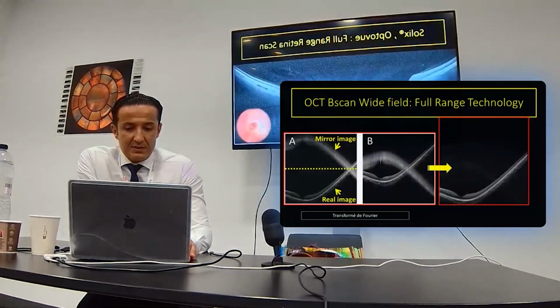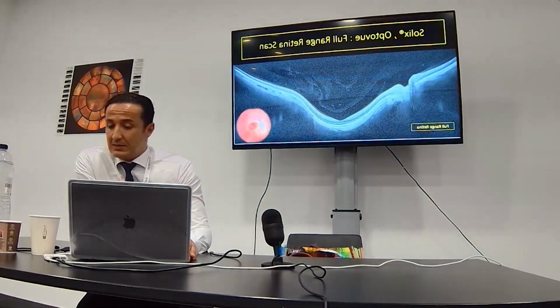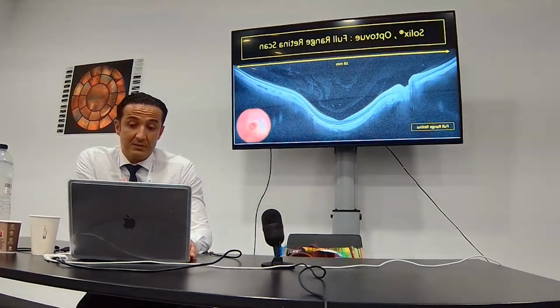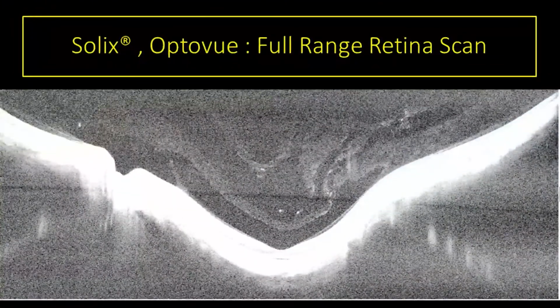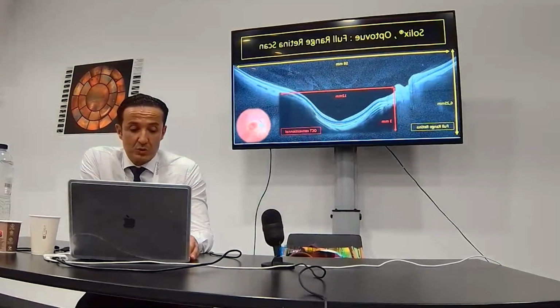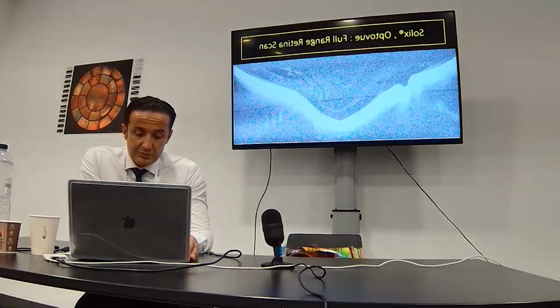And therefore, with this large scan, you can highlight the scan of a myopic patient, highlight the visualization of the vitreous component with a beautiful visualization of the premacular bursa and Martegiani area as compared to the conventional OCT with a small depth of 3 millimeters. And look here, the connection between the Martegiani area and the premacular bursa.